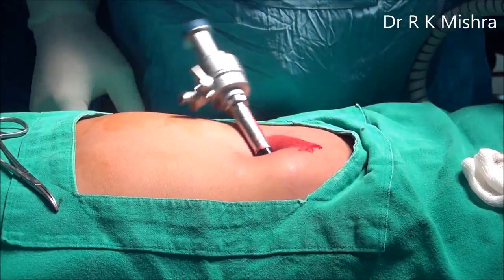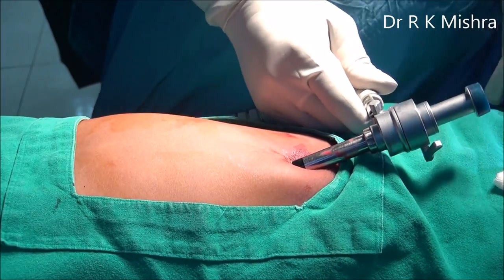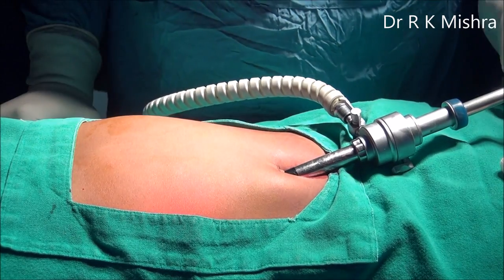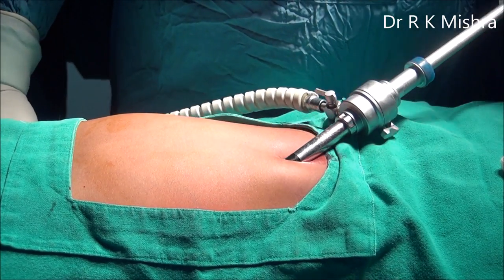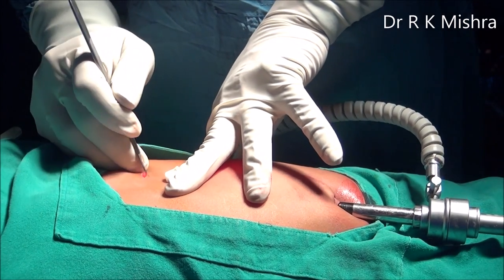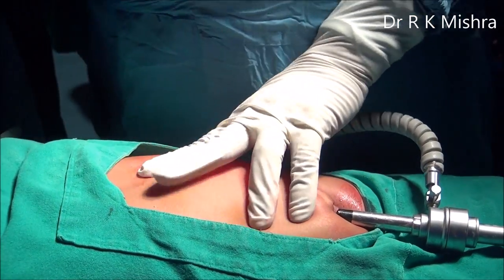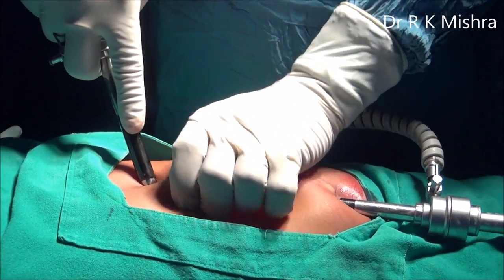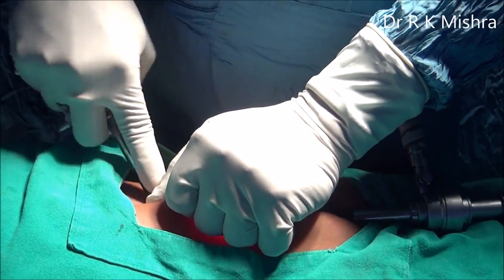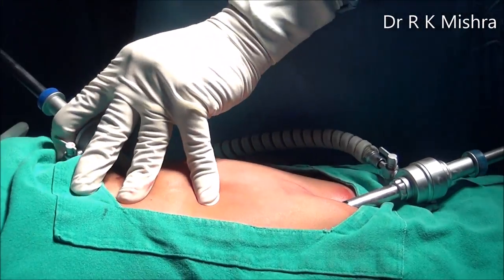In this procedure we have used only two ports: one at the umbilicus and another at the epigastric. The epigastric port, as usual, is placed just to the left of the falciform ligament. This is a small 10 mm incision epigastric, just left to the falciform. When you put the trocar, initially it should go perpendicular and then, as soon as it appears, it should pierce the membranous part of the falciform ligament and go towards the right.